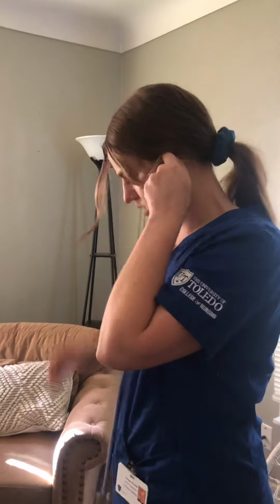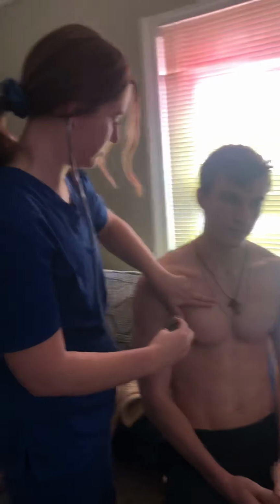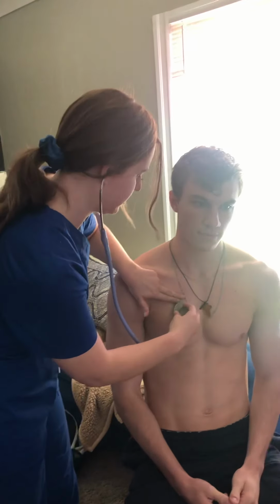I'm going to begin in the aortic area, which is on the right side of his body in the second intercostal space. So I'm going to listen in the second intercostal space on the right side.